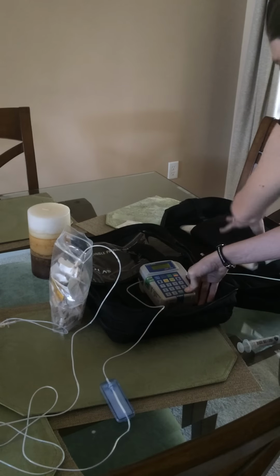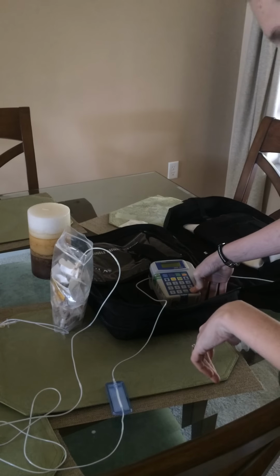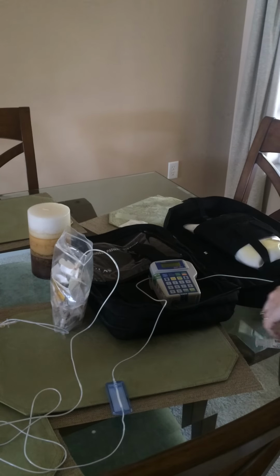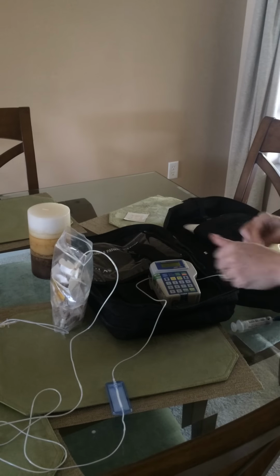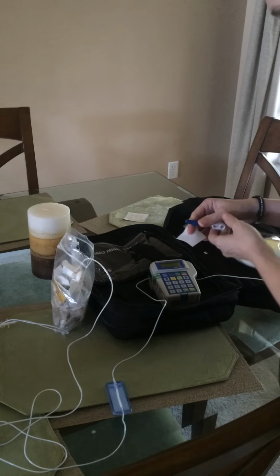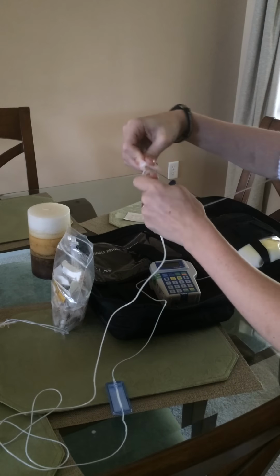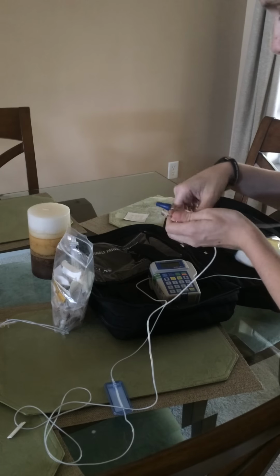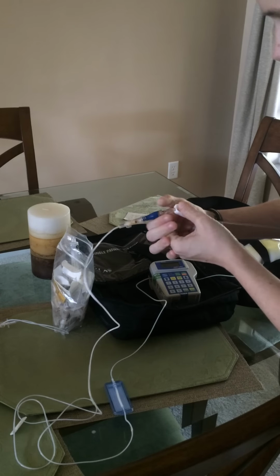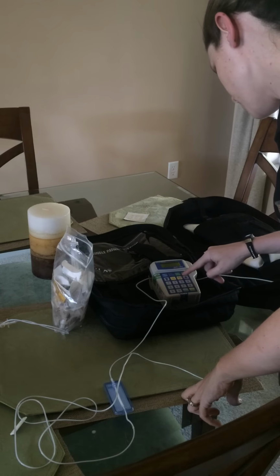So it looks to me as if all air has passed. Okay. So, even though I already did it, like I said, every single time, another alcohol pad. And this end. Twist it tight. Unclamp this. Like that. And now I hit run to start.